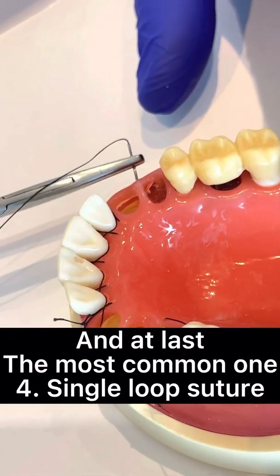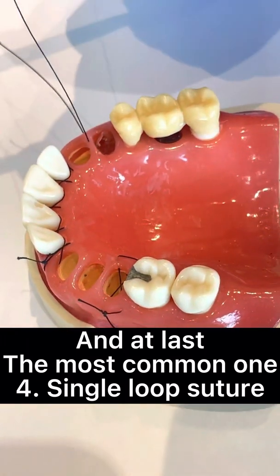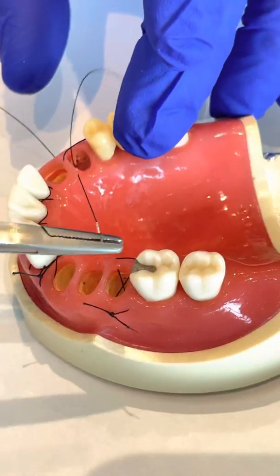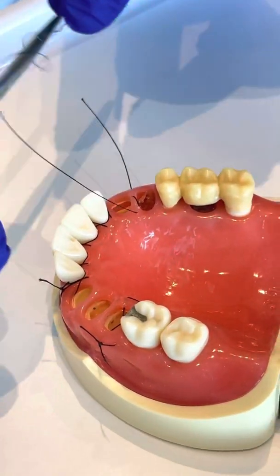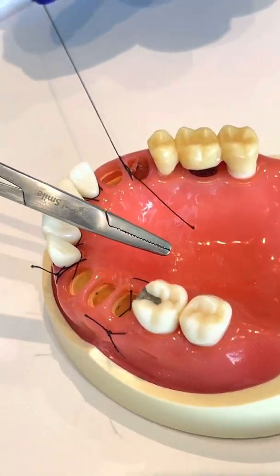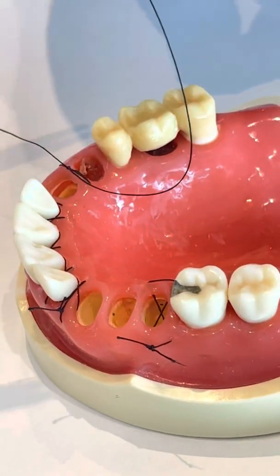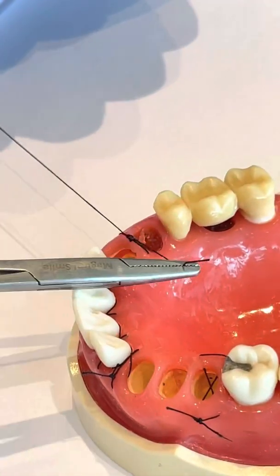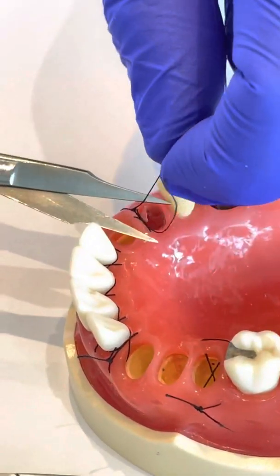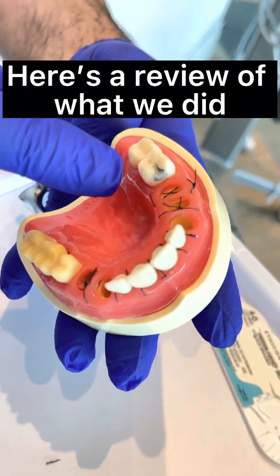Single Loop Suture. Here's a review of what we did.